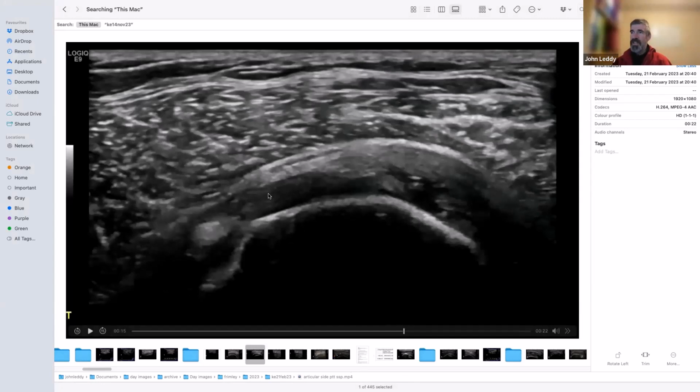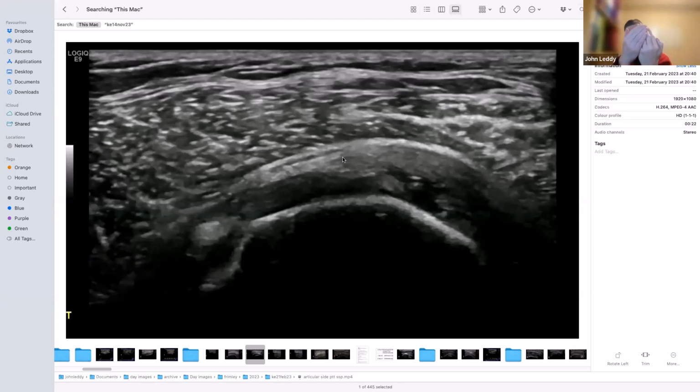If you use your imagination here, you've got the front of supraspinatus there, and then supraspinatus follows this line here, where you've got the tear. It delineates it, and infraspinatus is coming across here. How far toward the long head is infraspinatus coming? Well, in this case, it's coming to about 8 millimeters across there. So within about 8 millimeters, I would have said roughly. It's like if you've got a hand there, it's the supraspinatus, and then infraspinatus lies like that, with the biceps being here.